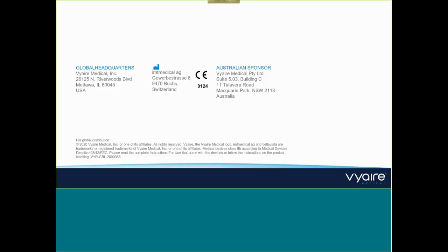So in the hospital here in Switzerland, they're using Sidestream capnography on their neonates simultaneously with transcutaneous, and they somehow average this so that they know, okay, transcutaneous might be, depending on the status of the baby, a bit too high. Sidestream might be a bit too low, so the truth must be somewhere in between, but this is a very luxurious approach. But the main challenge, as already said, is the leakage problem.